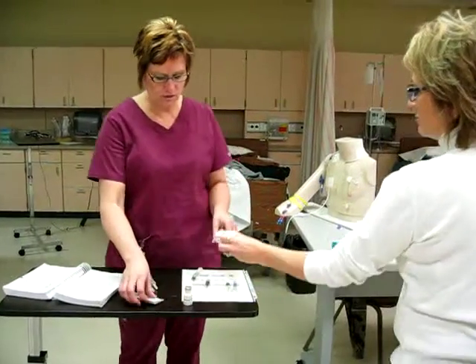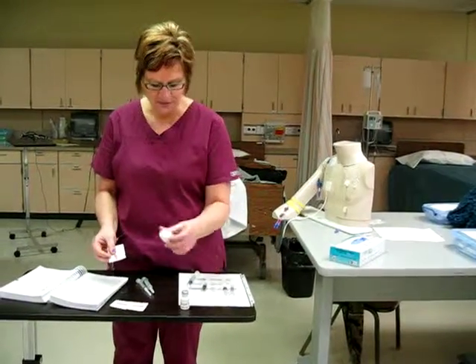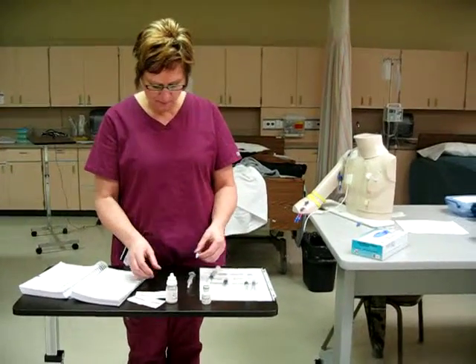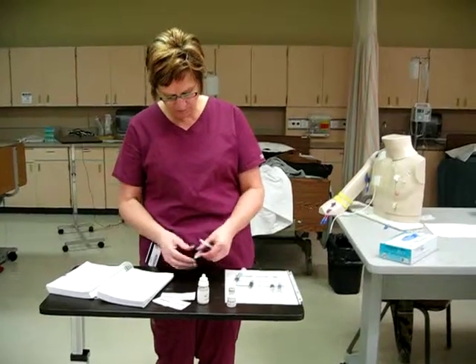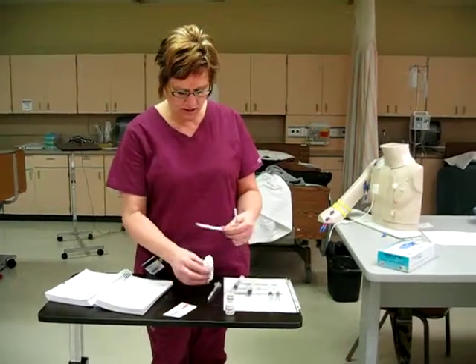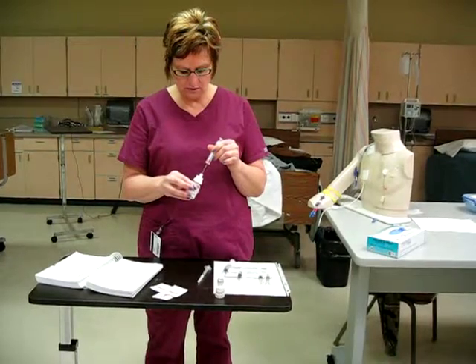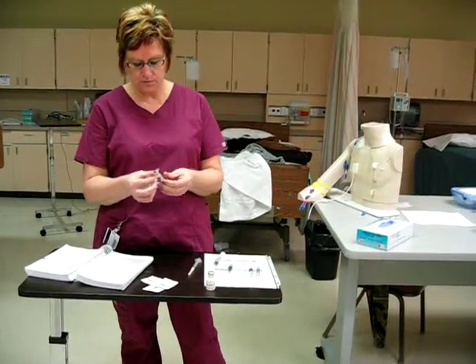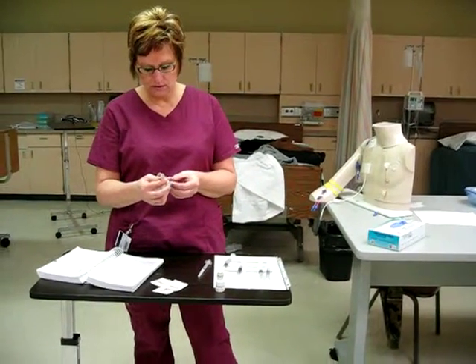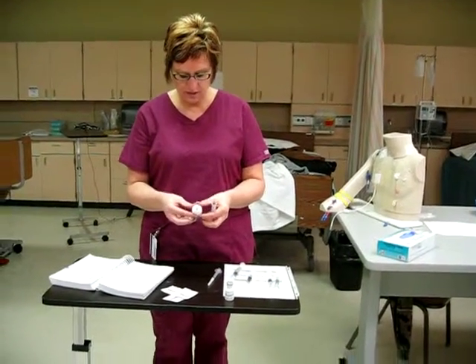Okay, so first I'm going to, Dilantin, I said it wrong, I meant Dilaudid. Okay, so first I'm going to use my 3 milliliter syringe. I'm going to alcohol off my Dilaudid, and I'm going to take out 1 milliliter. Okay, so I have 1 milliliter of Dilaudid.